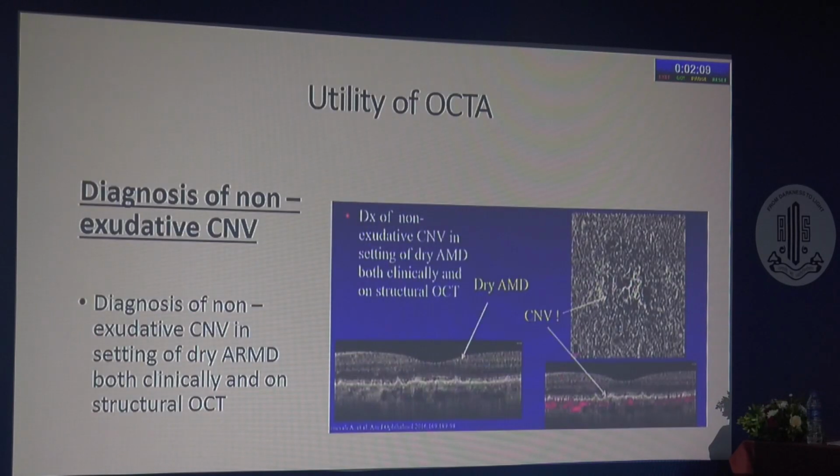So as I mentioned, I have seen a CNVM, but there's no fluid, there's no metamorphopsia. It doesn't mean that every OCT angio CNVM has to be treated, because if it's not leaking and it's dry, you may just wait. Injection is not to make the CNVM disappear, it's just to keep the retina dry.